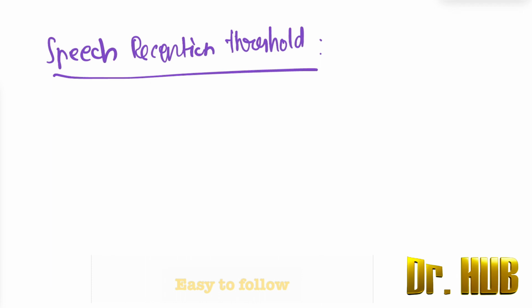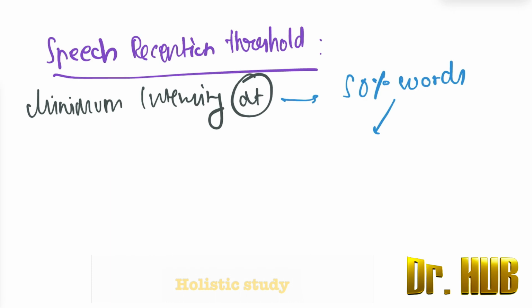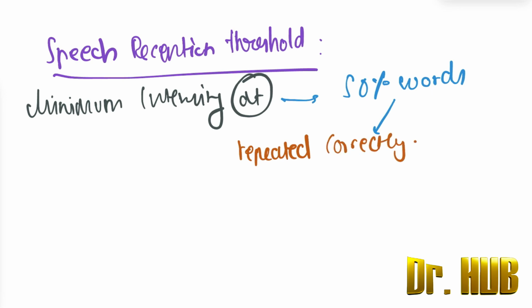Under this there is a minimal intensity at which 50% of the words are repeated correctly by the patient.